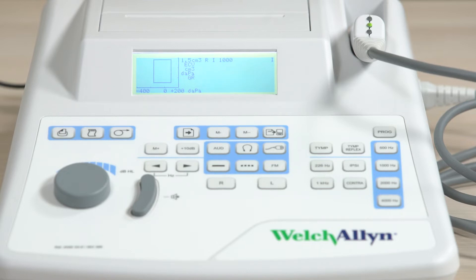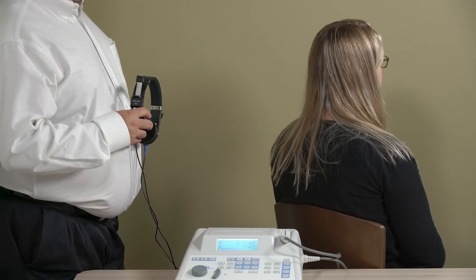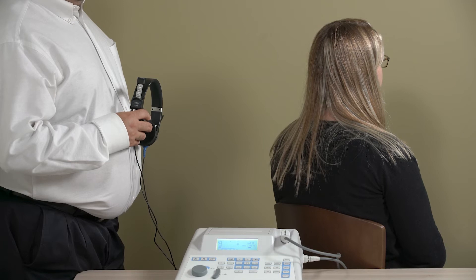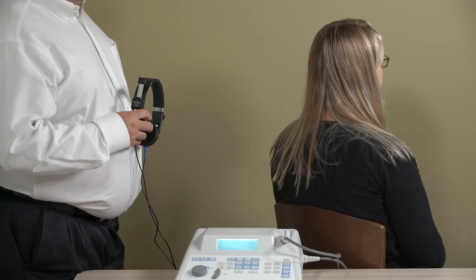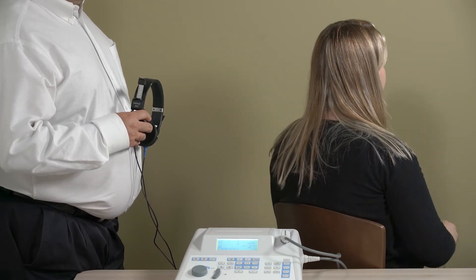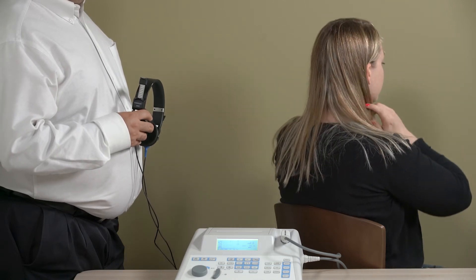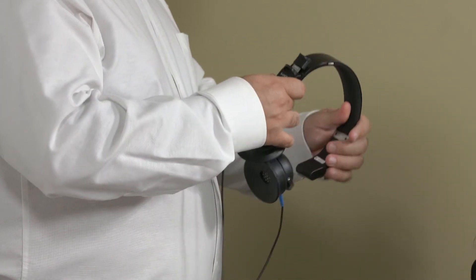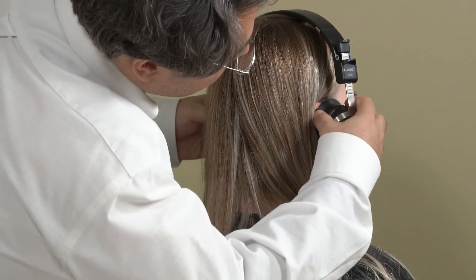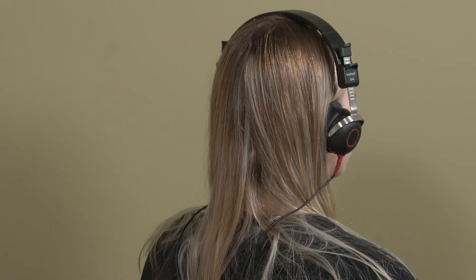To switch from audiometry to tympanometry, simply press either the audio or tymp buttons. Perform the test in a quiet room and seat the patient in a position where they cannot see you pressing buttons. The most important thing to remember is that a good seal is required between the earphone cushion and the patient's head and ears. Eliminate all obstructions between the earphones and the ears, such as hair, eyeglasses, earrings, or hearing aids. Adjust the headband so that it rests solidly on the crown of the patient's head and exerts firm pressure on both ears. Center the headphones carefully over the ears.